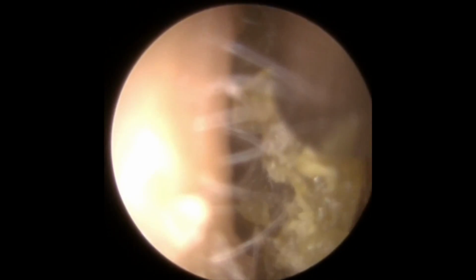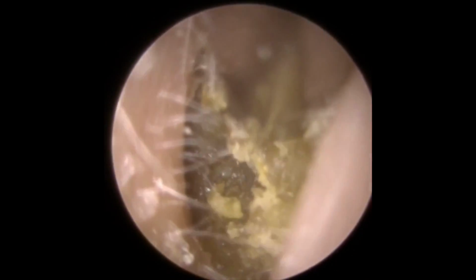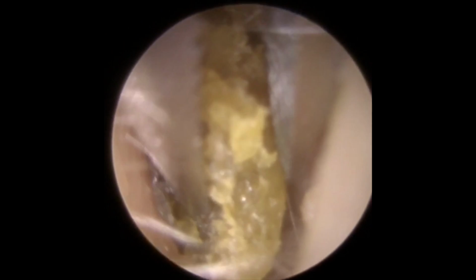Now we've got a point there now. Okay, so this is the standard size tube now going in. I'm holding the canal open using the endoscope, or the sides of the endoscope, and then trying to get a grip and trying to hold on. Sometimes with the wider end, we can break larger pieces off that will just get sucked straight into the machine, but even with a wider end, it's not breaking anything. So because we've got that slight point, I'm going to use the crocodile forceps. You can see there's barely enough room to get the forceps in either side of this wax.